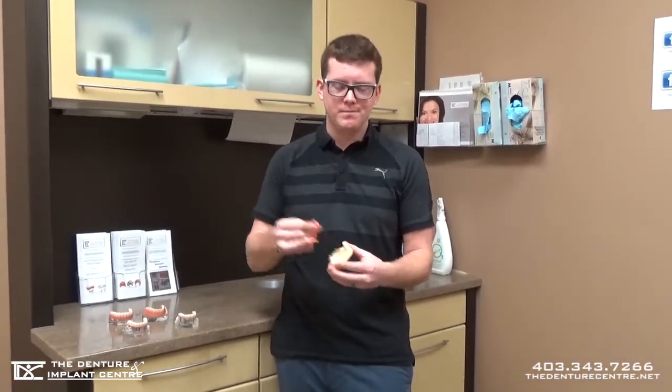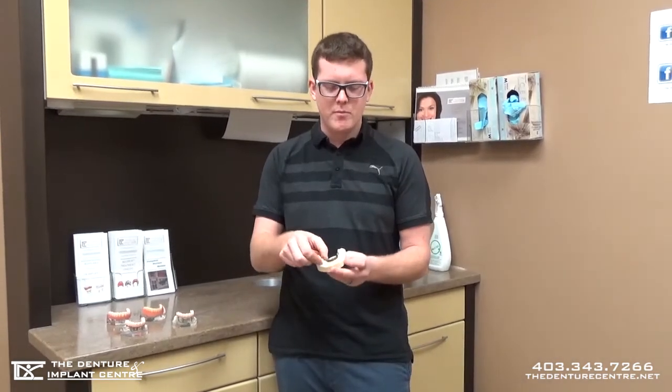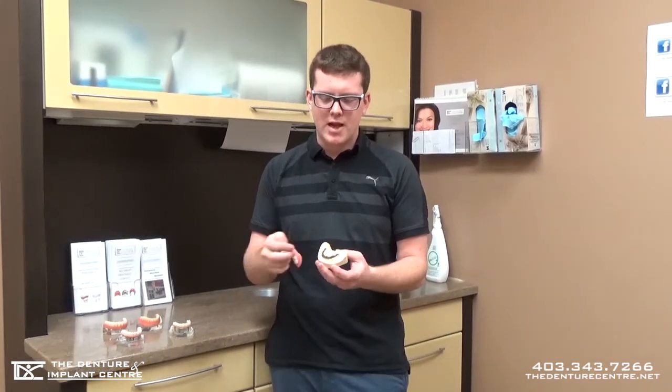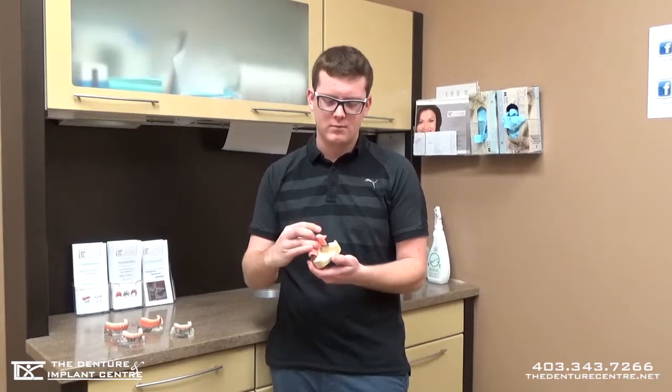The next option we have is what we call a bar over denture. Same thing — four implants with a milled titanium bar that physically screws down to those implants. Then the denture will have little attachments that hook onto this bar, and it snaps right in.